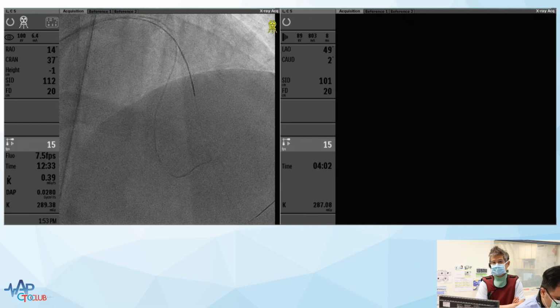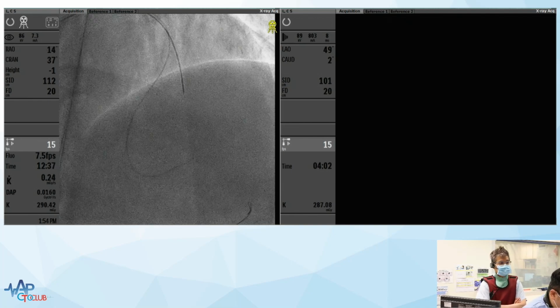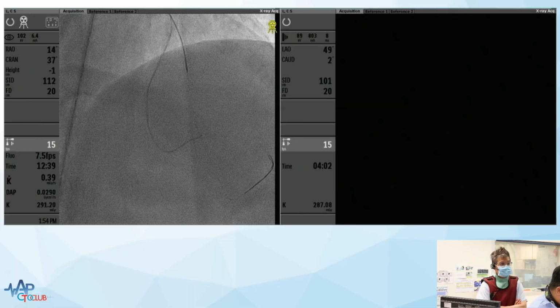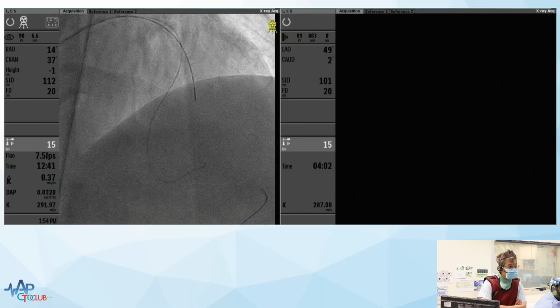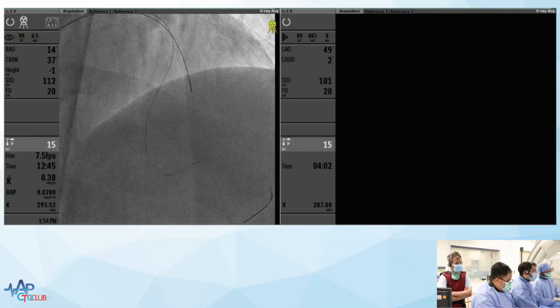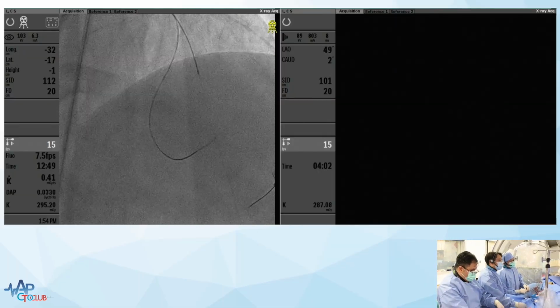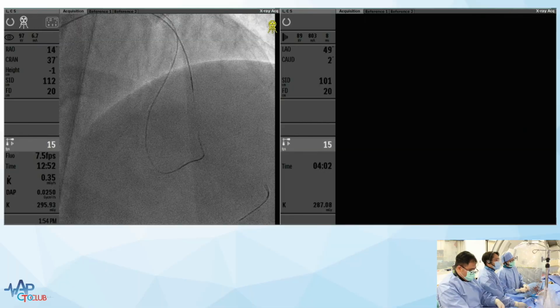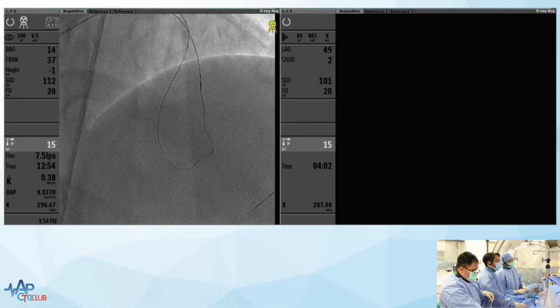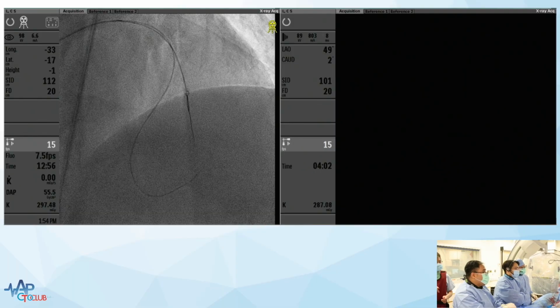Is that still the UB3 retrograde? Not very good. Is that still UB3? No, we exchanged to Suoh 03. Okay, this is Suoh 03. The UB3 is already gone. I'm happy now. Okay, Suoh 03 is in. So that's the point I made, that you should switch out for a soft wire to check the channel.